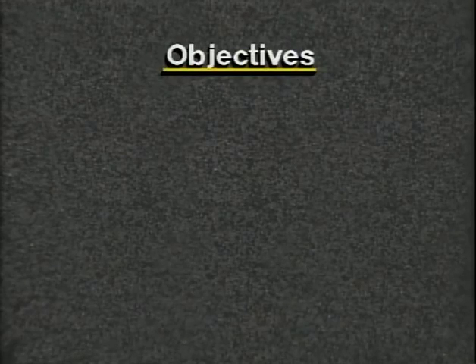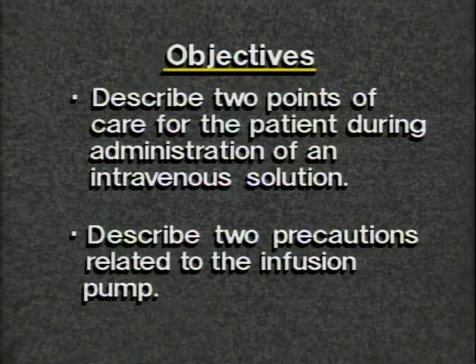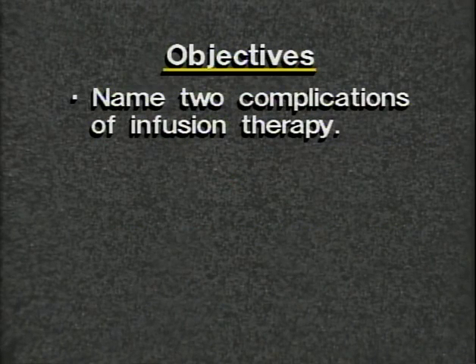This program is about care of the patient with a pump. After completing this lesson, you will be able to describe 2 points of care for the patient during administration of an intravenous solution. Describe 2 precautions related to the infusion pump. Name 2 complications of infusion therapy.